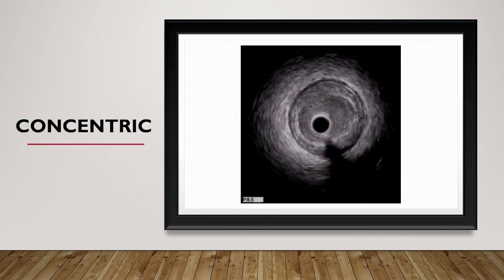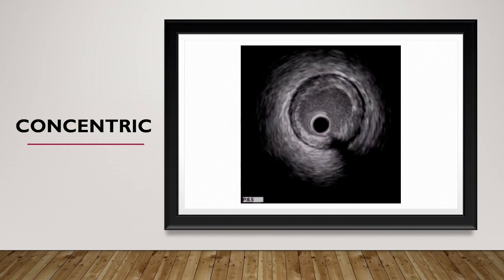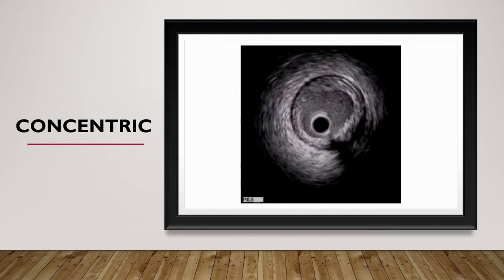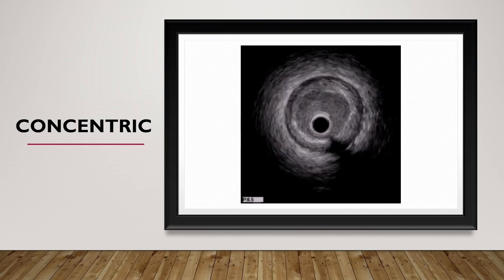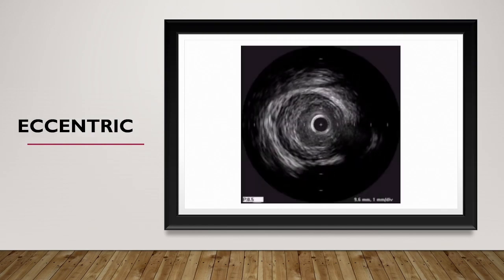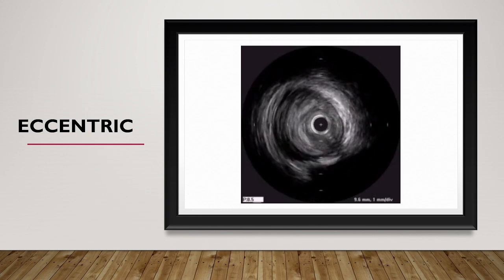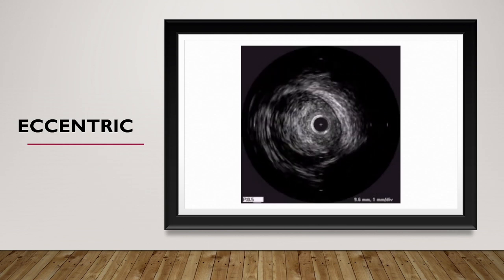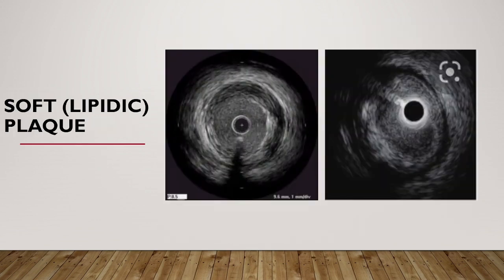Now coming to the concentric plaque, if you have this kind of plaque, there is some ingrowth inside the lumen all throughout, in a concentric location. So this we call concentric plaquing. And eccentric ones are like this. One side is free, the other side is totally diseased, almost occluding the lumen. So it can be concentric, it can be eccentric.